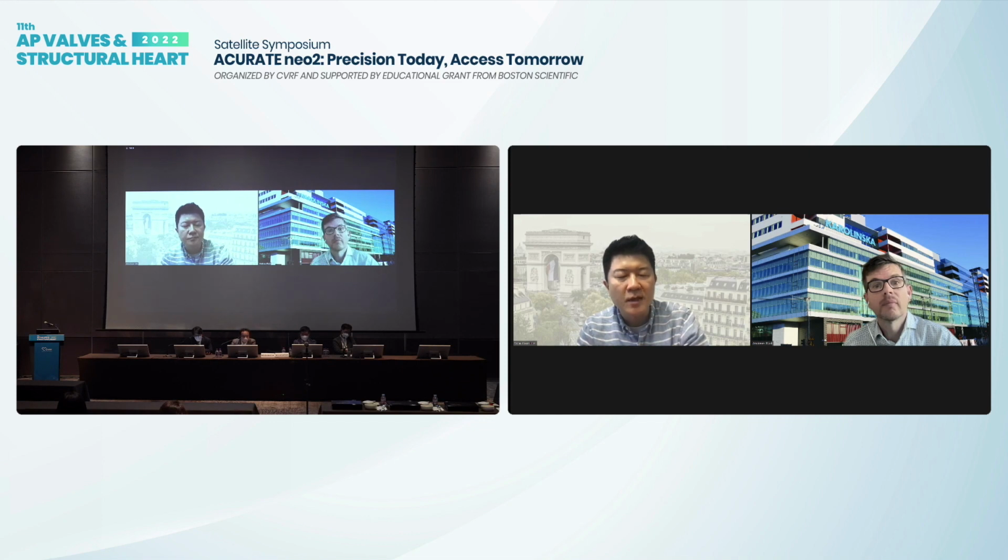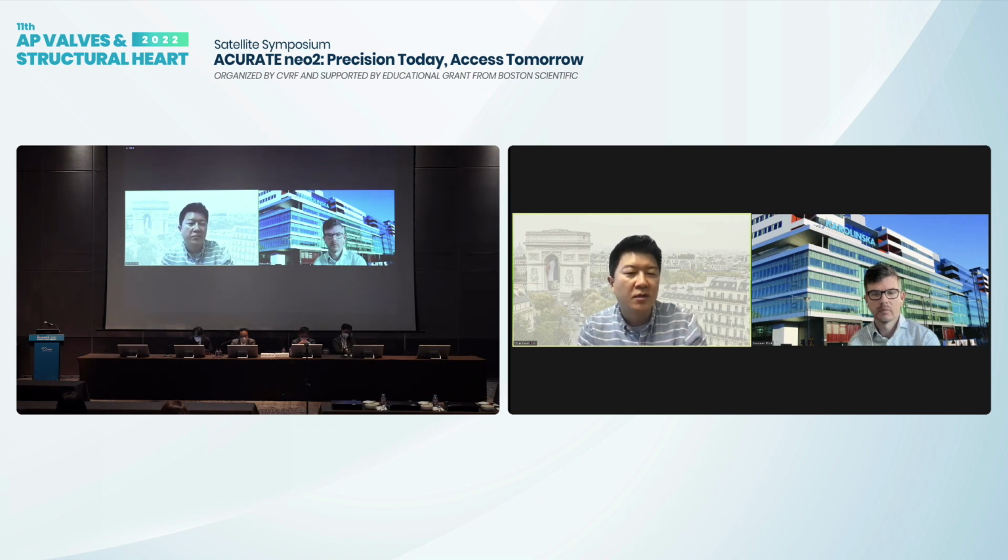So the injury of the upper crown is extremely rare. It's not that it never happens. I had one case after post-ballooning where the upper crown caused aortic dissection. That's true. But this is after we've done around 2,000 cases in our center. And this is one of 2,000 in a very small anatomy. I think no valve is perfect, and if there are so many different difficult anatomies out there, I think you can classify it as extremely rare. But of course, we have to keep in mind that this could happen. Okay. Any question? That's it.